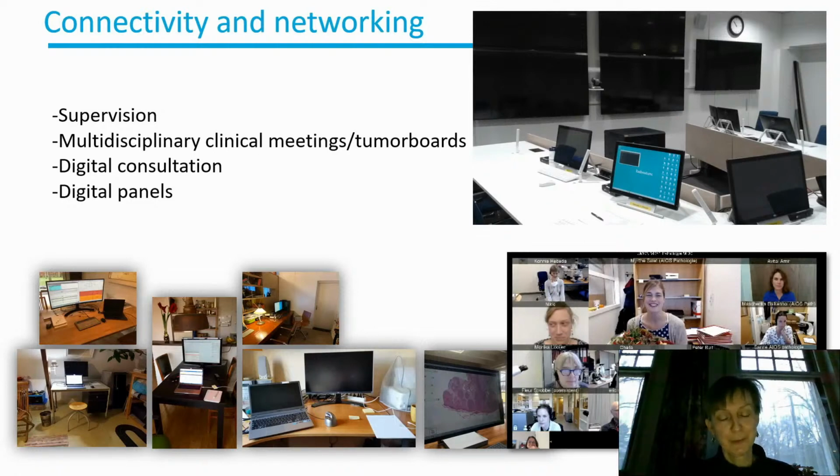These were the first working spaces that were installed, so we were still able to work from home during the whole time. And of course, for digital consultation and for panels, for example national tumor panels, it's very helpful to have good quality digital slides that you can really share and look at together.